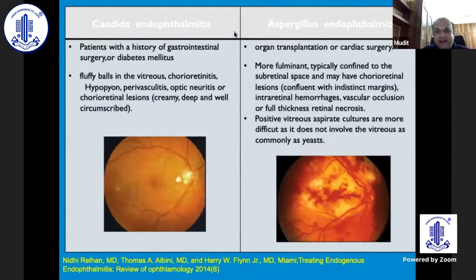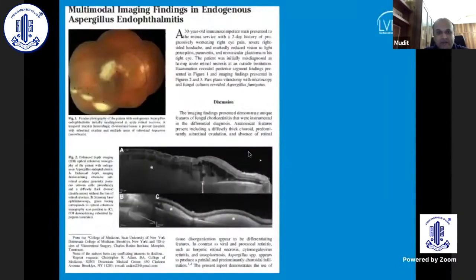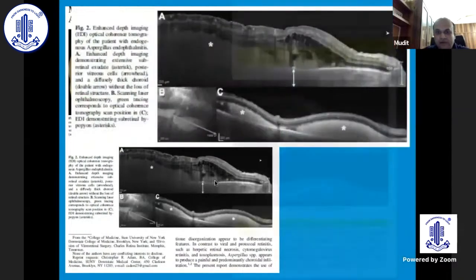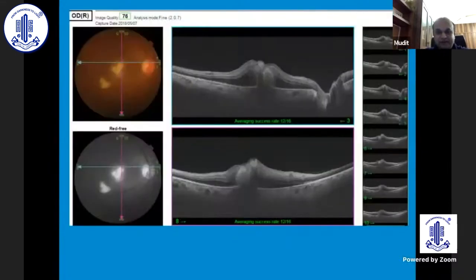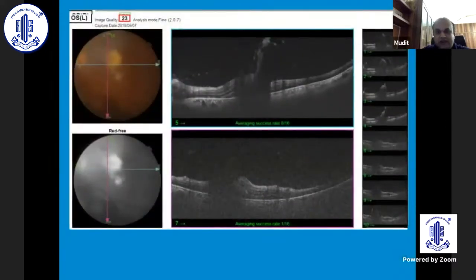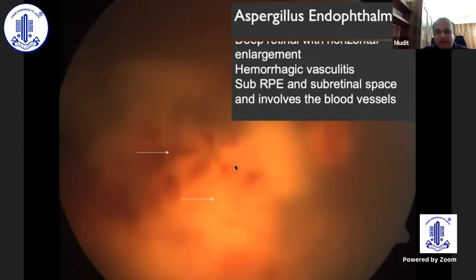Moving on to Candida and Aspergillus endophthalmitis: in endogenous endophthalmitis from Candida, OCT can show a characteristic lesion that has broken through, described as a rain cloud sign — you see vitritis and an evolving lesion. Compared to that, endogenous endophthalmitis secondary to Aspergillus may show a more widespread, diffuse lesion. This patient with two elevated lesions and retinitis involvement on OCT showed the characteristic features — this was a case of Candida endophthalmitis with the characteristic rain cloud pattern. Aspergillus endophthalmitis, like I said, has a more diffuse involvement.